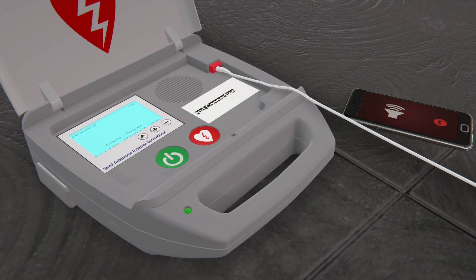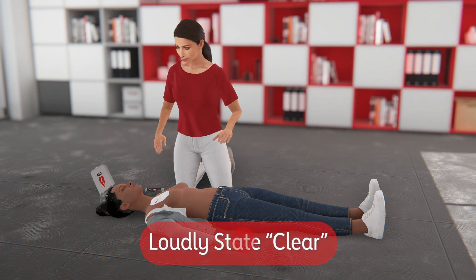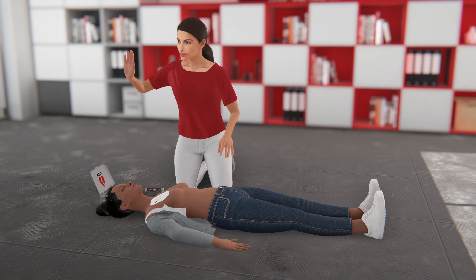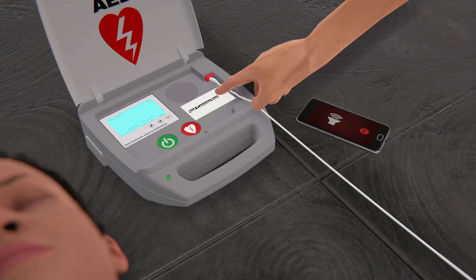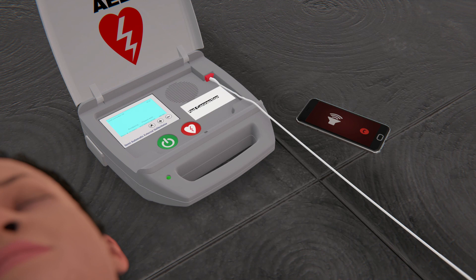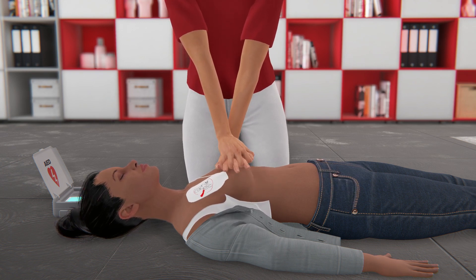If the AED advises a shock, it will say: "Shock advised. Charging. Stay clear of patient." Deliver a shock — loudly state "clear" and make sure that no one is touching the person. Push the shock button. Once the shock is delivered, immediately resume hands-only CPR until help arrives or the AED prompts you to pause.